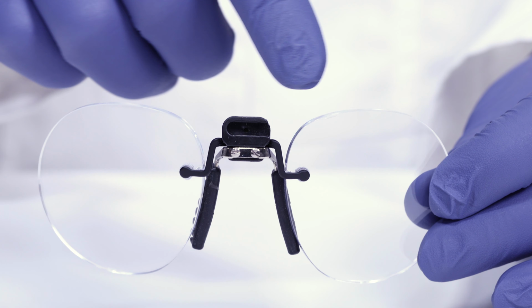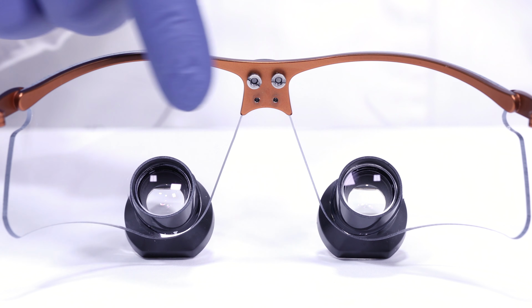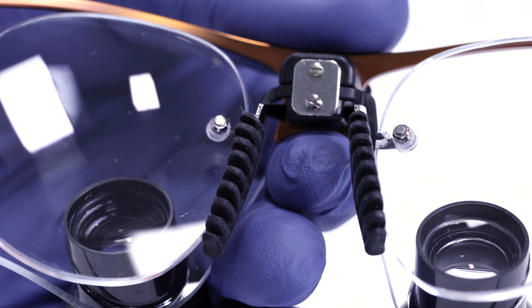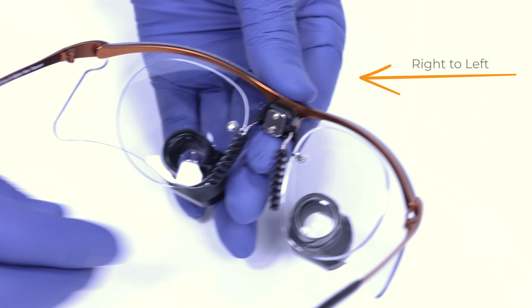The back of your prescription insert has a mount that slides over the 2 shoulder screws on the back of your Eclipse frame. To install the insert, hold the frame firmly with the telescopes pointing away from you, and slide the prescription insert's channel horizontally from right to left over the shoulder screws until it is fully seated.